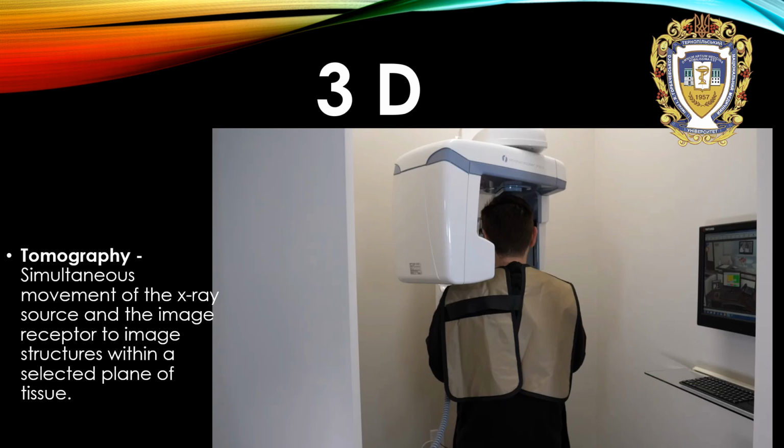Tomography. What is this tomography? It is simultaneous movement of the X-ray source and the image receptor to image structures within a selected plane of tissue.